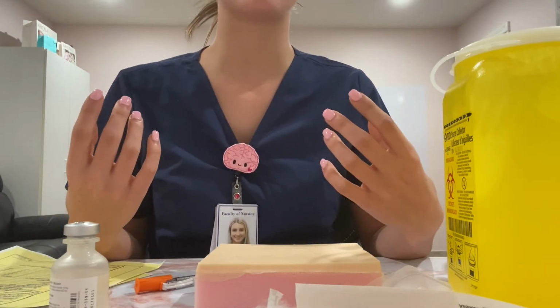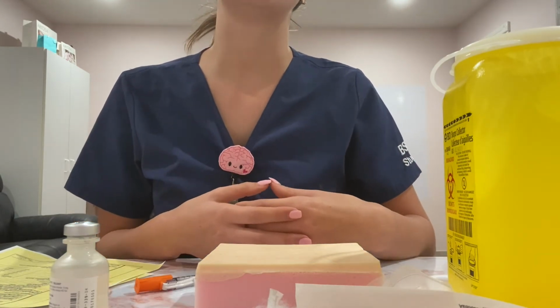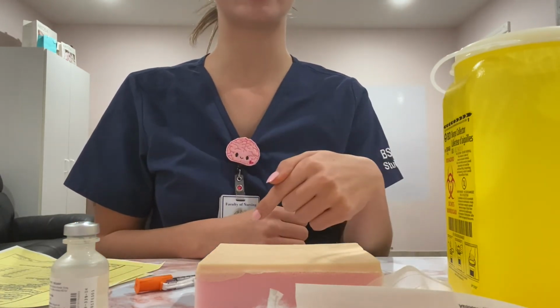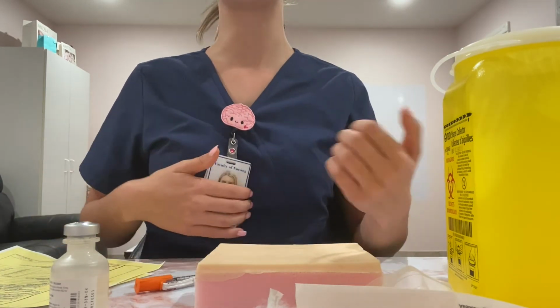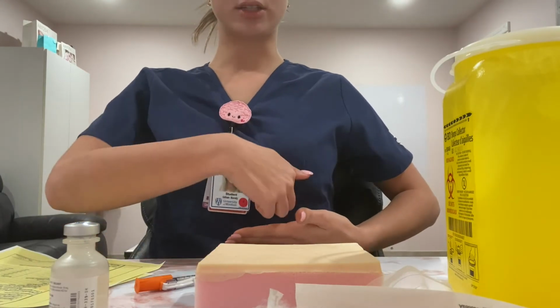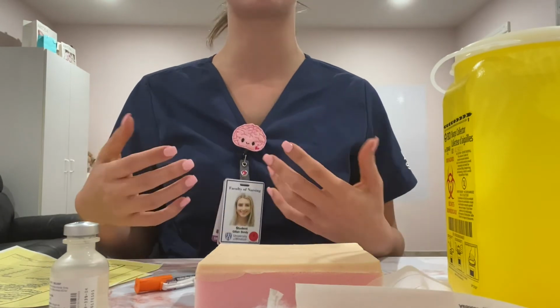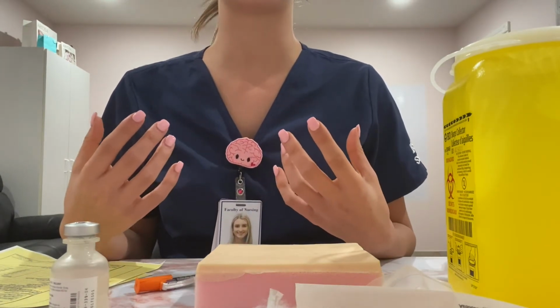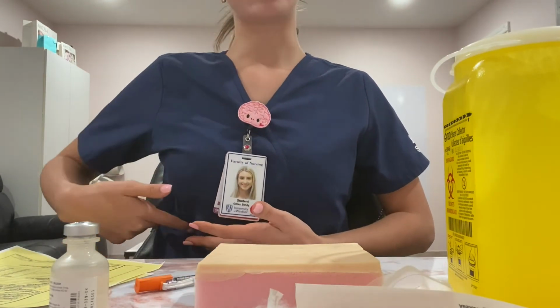And to avoid all of these, it's important to rotate the site of the injection. So to do this, you can rotate between the 3 different injection sites, or if they're unavailable, you can divide the abdomen, for example, into 4 quadrants and inject into a different quadrant each time and rotate clockwise. And then you can document the site that you injected into so that it's not used too often, and say that you used the right upper quadrant.